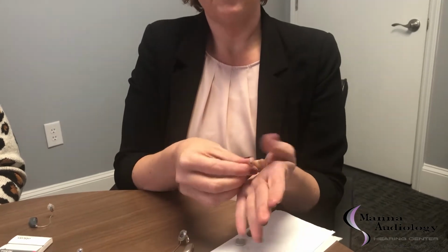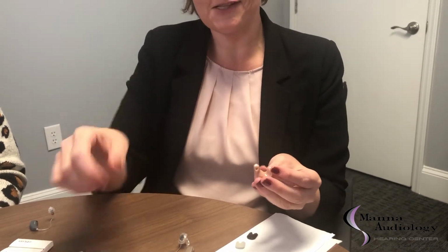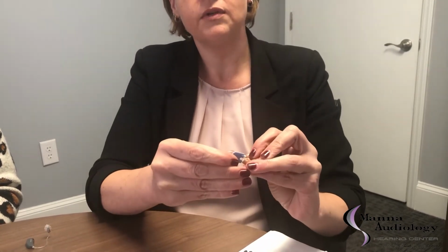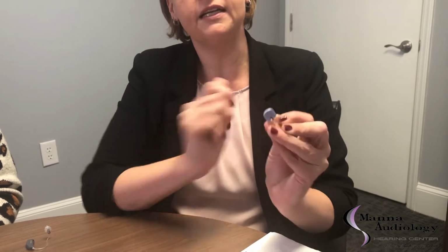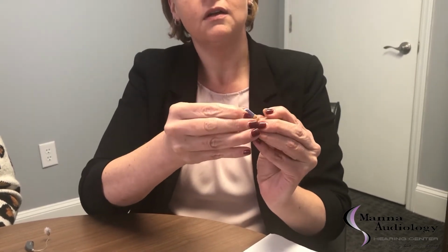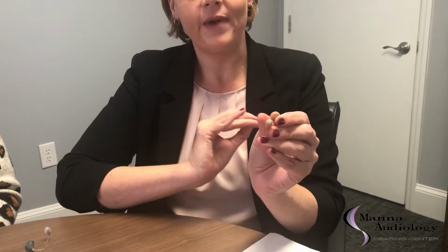And last but not least, I have an example of what we would call a custom hearing aid. Now, this guy actually uses a different size as well. He has a blue tab. So again, you're gonna pull it off, taking that removal tool, I'm gonna snap it right into place. You're gonna pull that guy out and put the replacement back in.